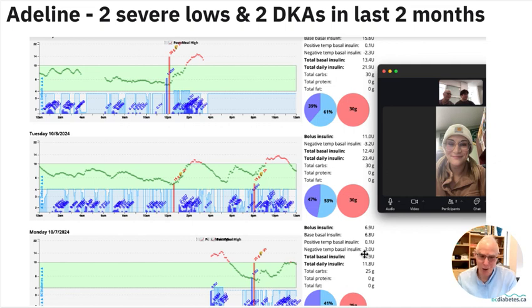So anyway, I had a good chat with Adeline, and we went over sick day management. We went over diabetic emergencies. We went over what happened with her 2 DKAs and her 2 severe lows, and I made the decision that we would install her app anyway.